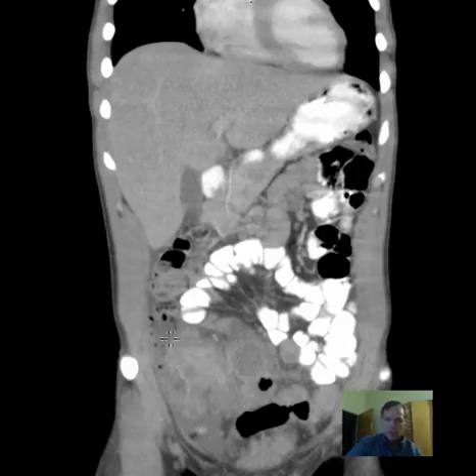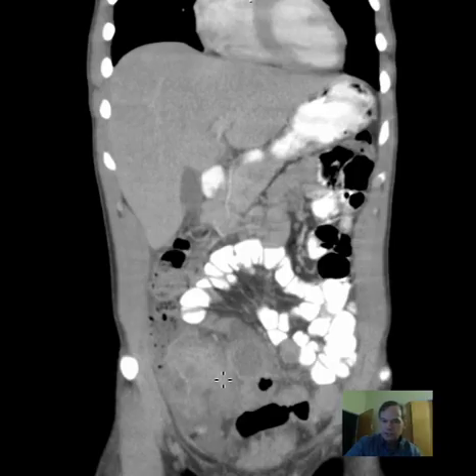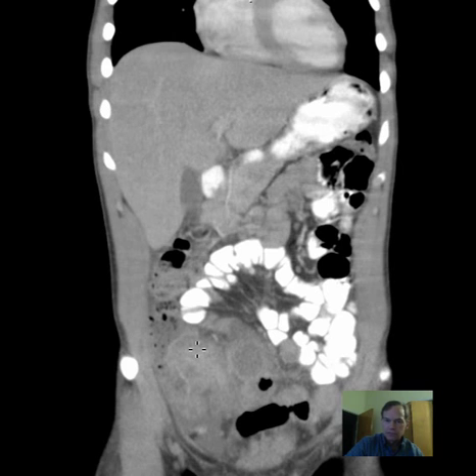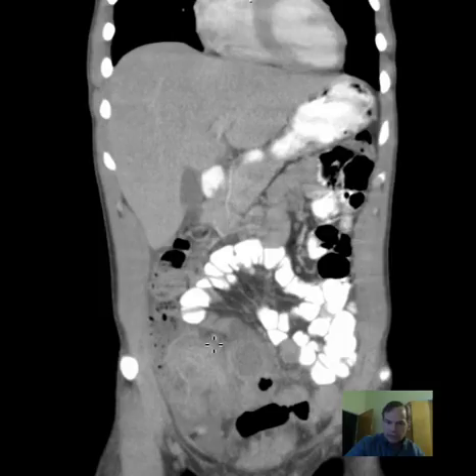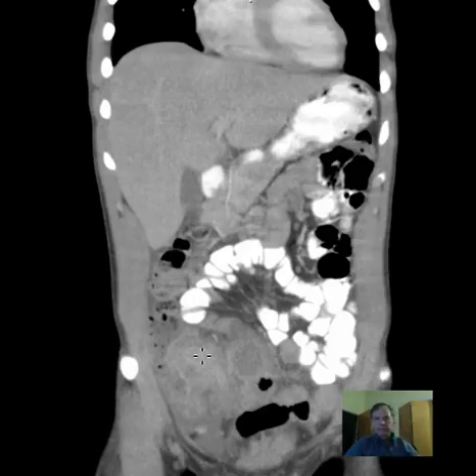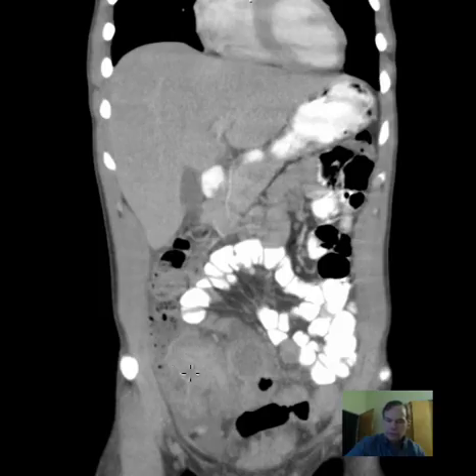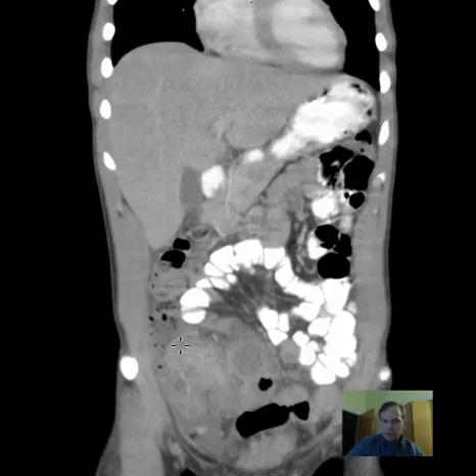That would be exactly where I would expect the terminal ileum and ileocecal valve to be located, and there is exuberant edema there. We can see that there is edematous tissue coursing up to that. I believe that this is very edematous inflamed terminal ileum and ileocecal valve, and that suggests most likely Crohn's disease.